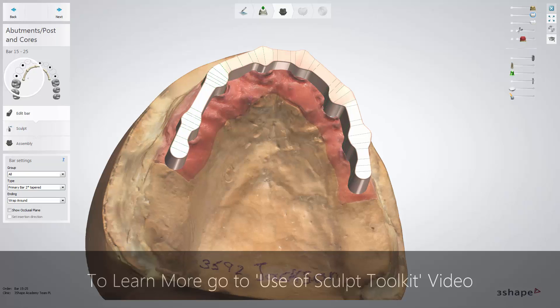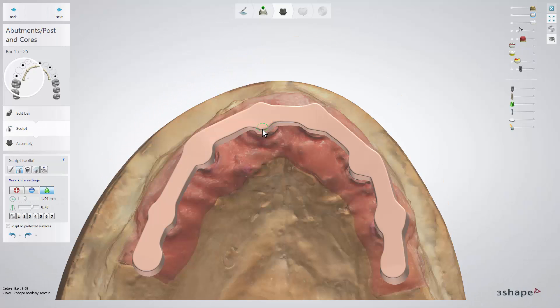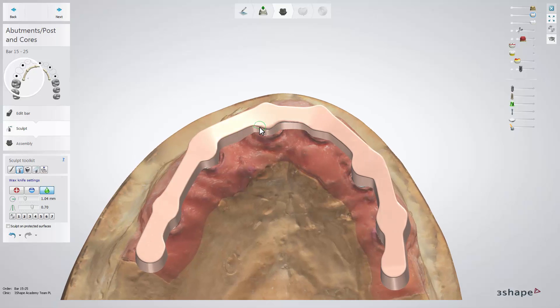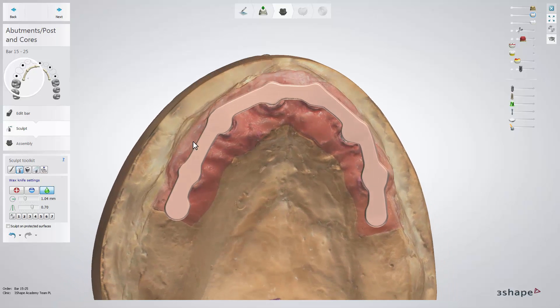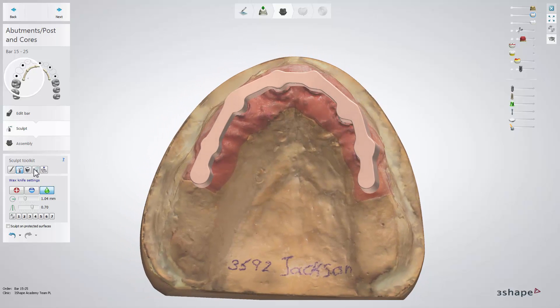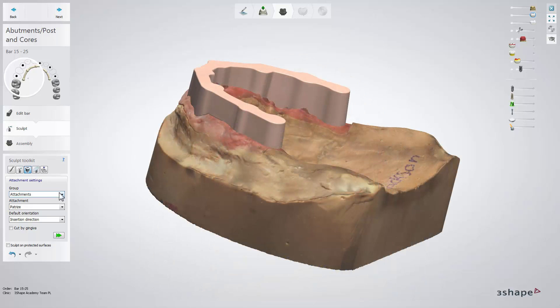Once the bar and abutments have been adjusted, click next to go to the sculpt step, where you can make adjustments to the bar structure using the sculpt toolkit tools. You can add an attachment here if your design requires it. In case you need to adjust the bar structure for any reason, such as attachment fitting, remember that you can always switch between the design steps without losing your design.